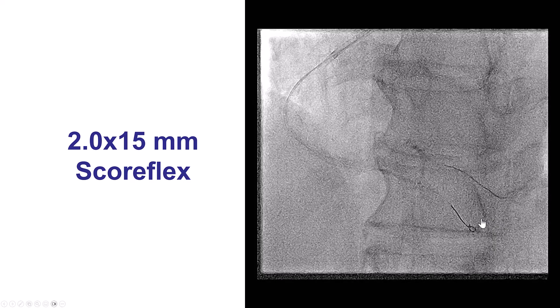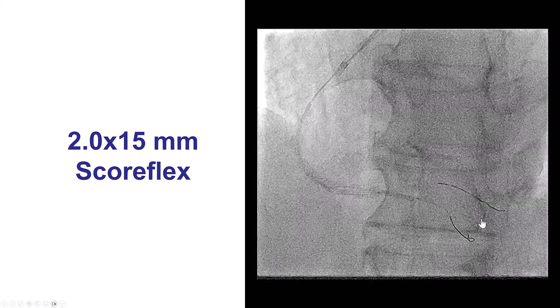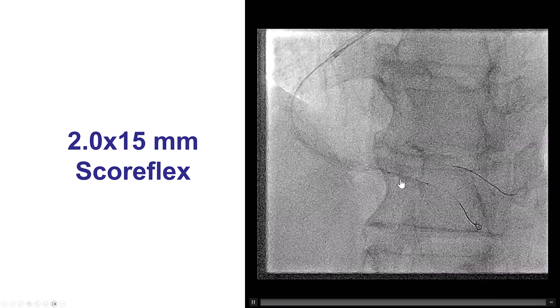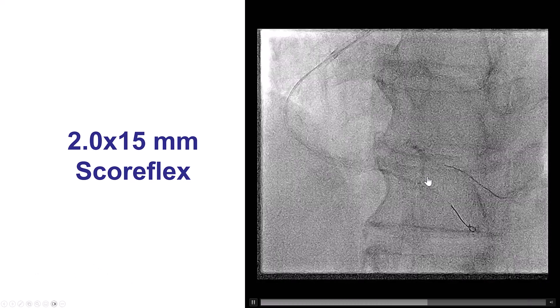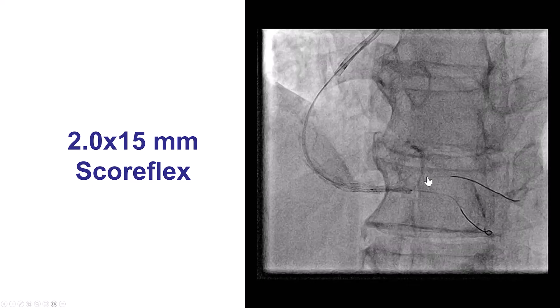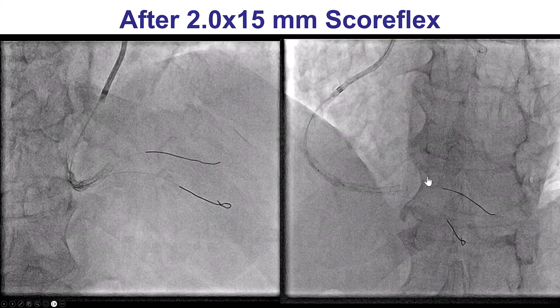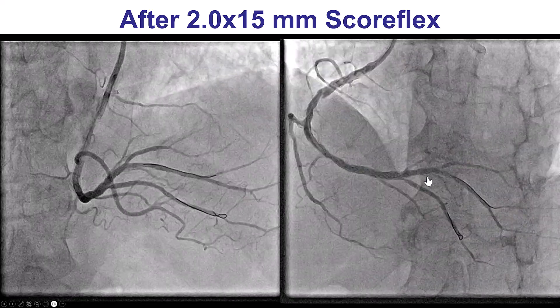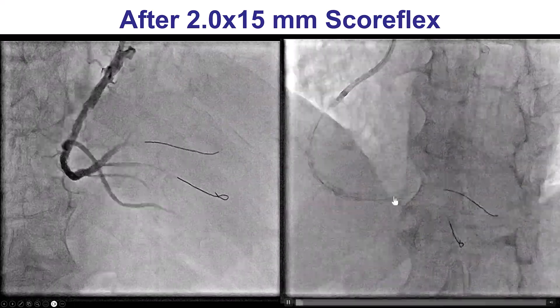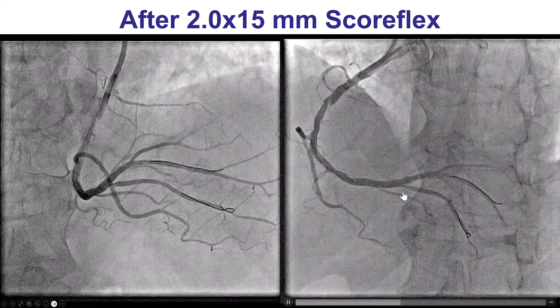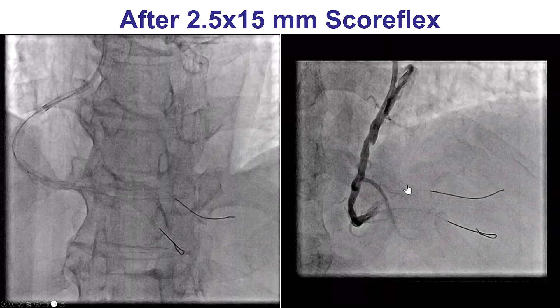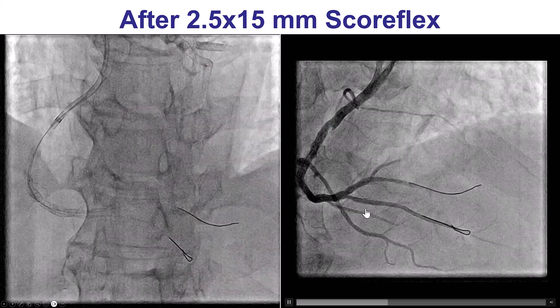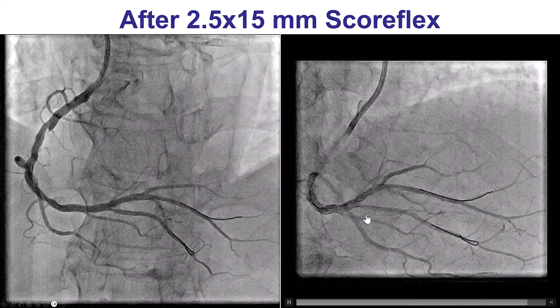We then did balloon angioplasty. For side branches, we often like to use scoring balloons, so we used a ScoreFlex here to minimize the risk of causing a dissection into the side branch. We used a 2.0 and 2.5 mm ScoreFlex. The 2.0 didn't really significantly improve the lesion, so we used the 2.5 mm, and after that the PDA does look, at least angiographically, fairly good.